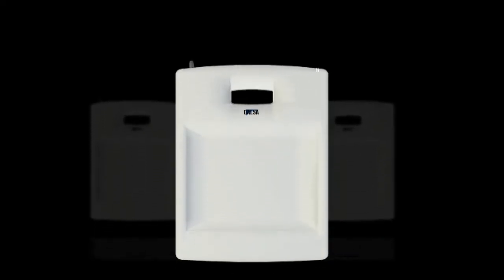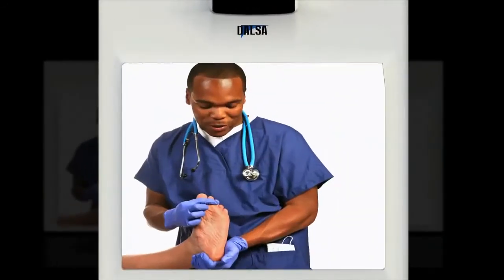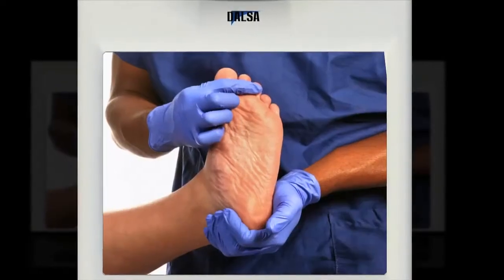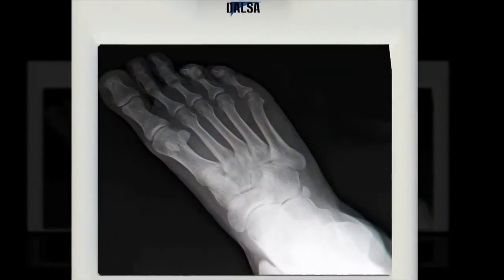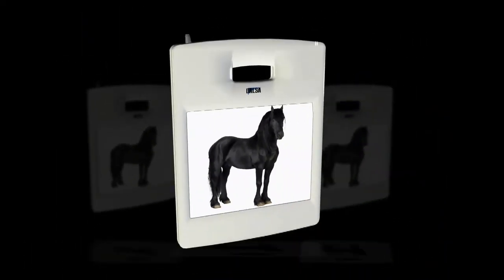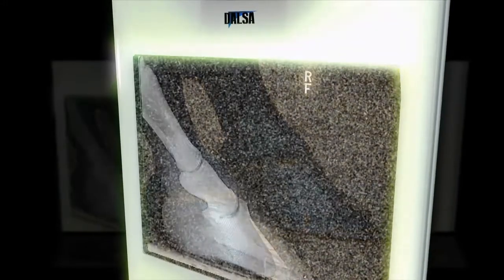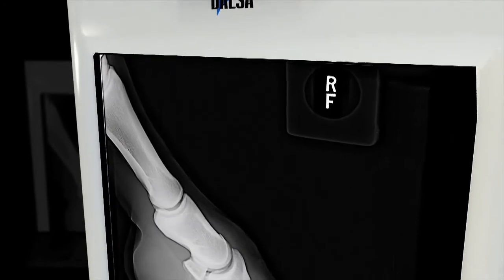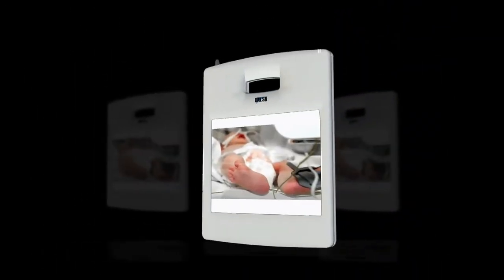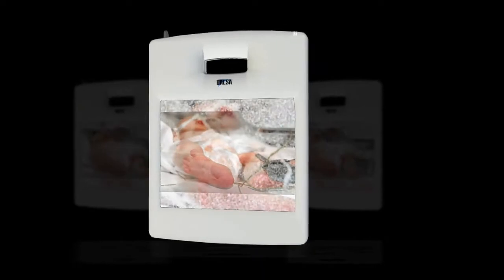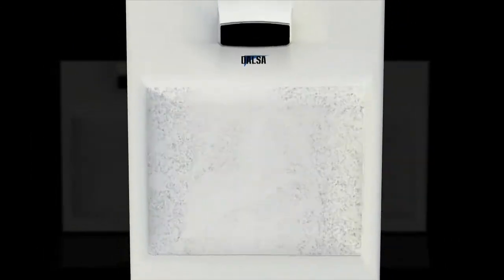For static snapshot x-ray, Helios is Teledyne DALSA's portable CMOS flat panel detector. With low power and low weight, Helios is designed for low dose performance with great ease of use. Helios breaks new ground in resolution and noise, showing more details at lower dose than traditional flat panel detectors. Helios has the very high dynamic range required for single shot x-ray imaging, showing details in less dense soft tissue areas as well as very dense skeletal areas all in a single shot. With simple Gigabit Ethernet connectivity, Helios can connect to almost any PC to capture high quality images almost anywhere.